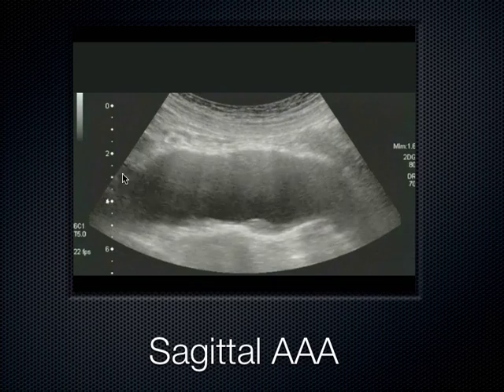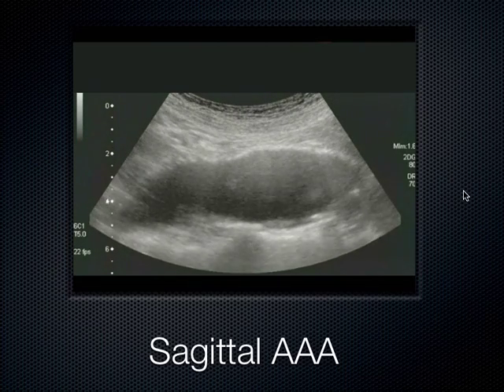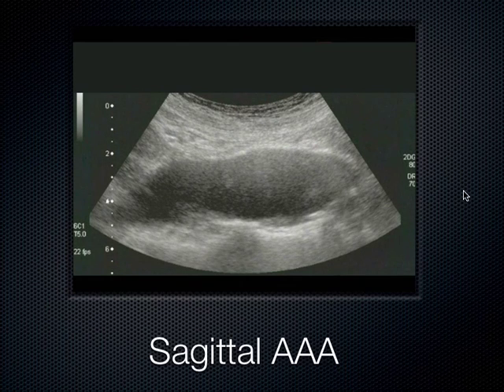Here we're going sagittal to show you what one looks like. It looks like a big sausage stretching across the screen here on a sagittal view. It's kind of cool to see those that way sometimes.